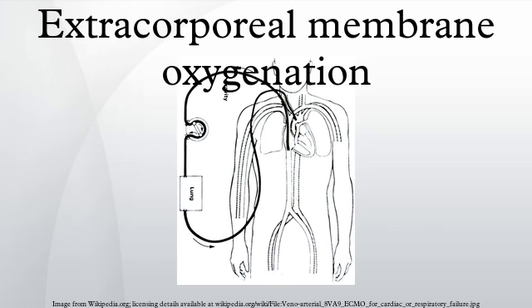Diuresis: since most patients are fluid overloaded when ECMO is initiated, aggressive diuresis is warranted once the patient is stable on ECMO. Ultrafiltration can be easily added to the ECMO circuit if patients are unable to produce sufficient urine for diuresis. Left ventricular monitoring: left ventricular output is rigorously monitored during VA-ECMO because left ventricular output can become worse.